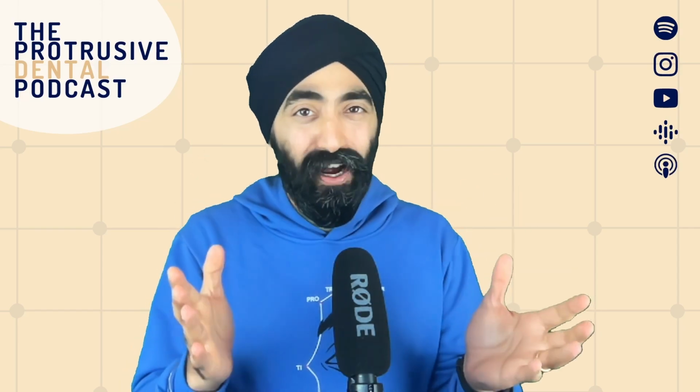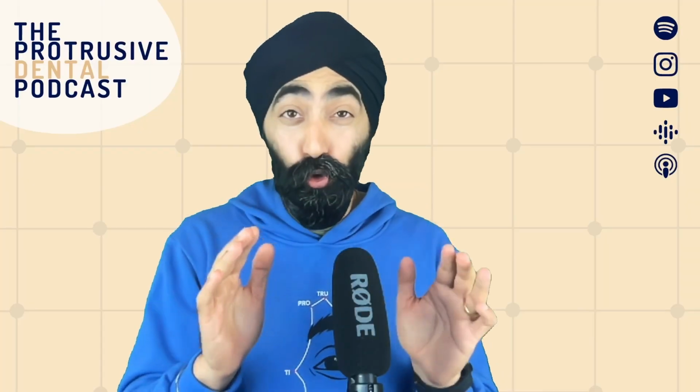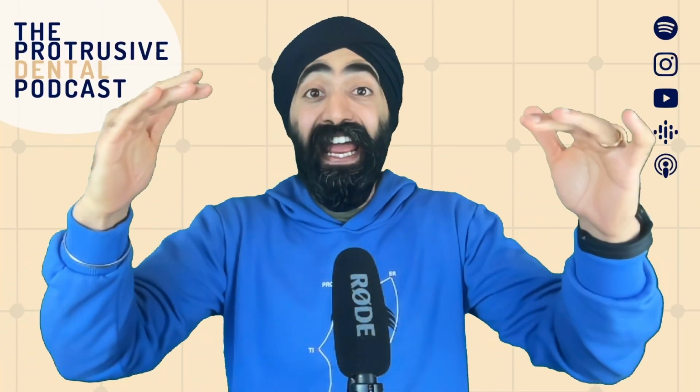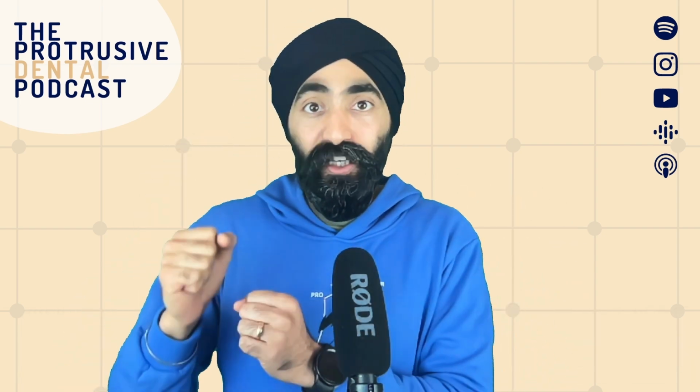Have you ever got a crown or an onlay back from the lab and tried it in the mouth and thought, whoa, the occlusion is just way off? Either it's in infra-occlusion, i.e. it's not even in the bite at all, or it's in supra-occlusion.